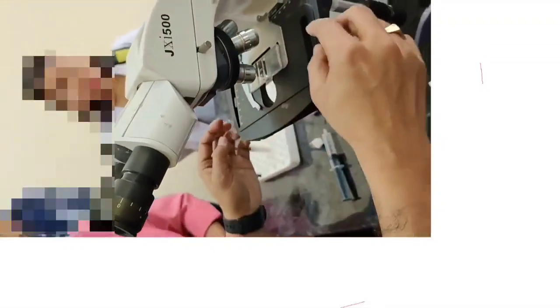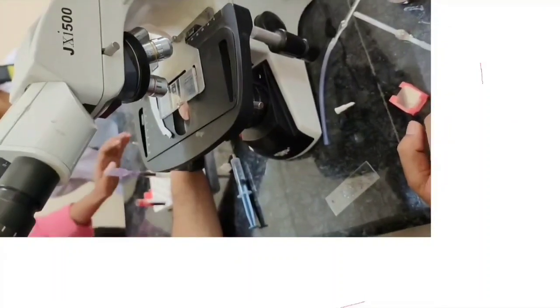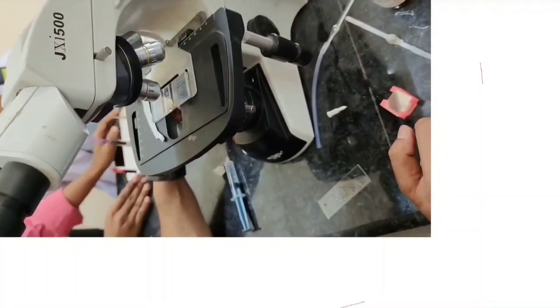We can see here the fluid is in between the cover slip and the glass slide. There is a gap of 0.1 millimeter, and within that gap we have filled the diluted fluid from the bulb area. And now we are going to focus.